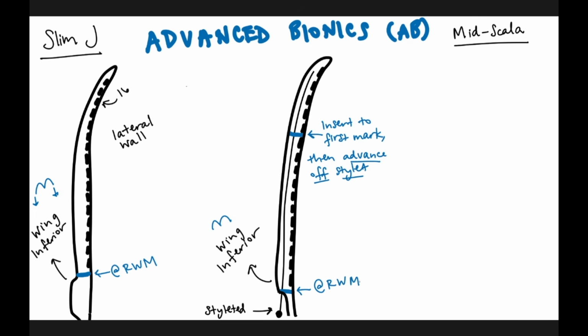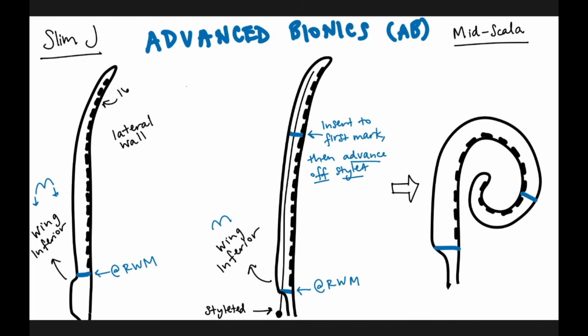Without the stylet, the electrode springs into its pre-curved shape. This electrode also has 16 contacts, 5 between the tip and the first blue line, and 11 between the first and second blue lines. If there's a tip fold over or incomplete insertion, it can be removed and the stylet reloaded up to 3 times for repeated attempts.